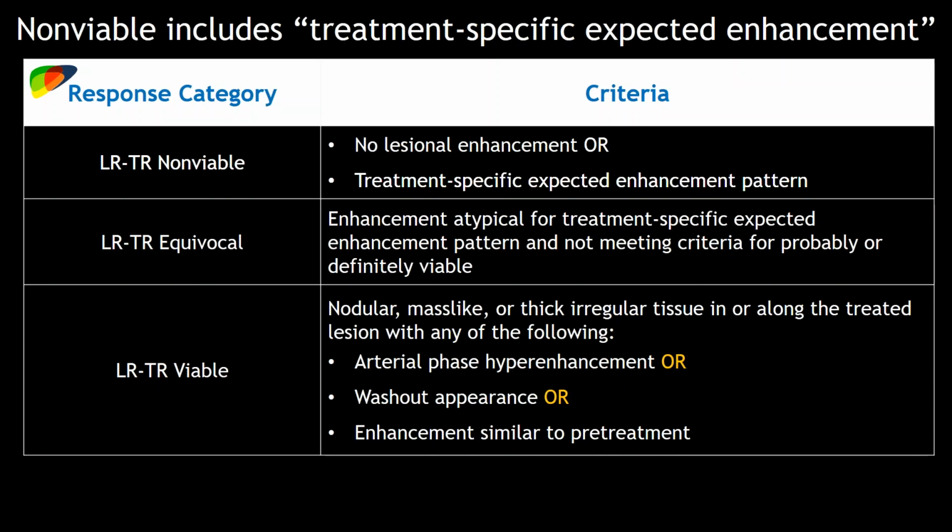That sometimes creates confusion in our scenarios when we use SBRT as a bridge for patients for liver transplant, because the tumor bed starts showing heterogeneous enhancement, especially in lesions close to the falciform ligament or the liver hilum. But we start seeing the appearance of portal vein thrombus, and then we are divided on whether it is really tumor or just secondary to the effect of the SBRT. Any comments, any experience you have on that?